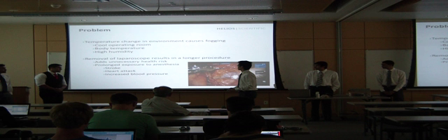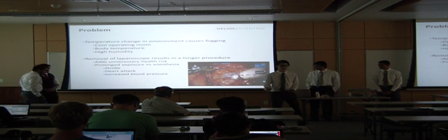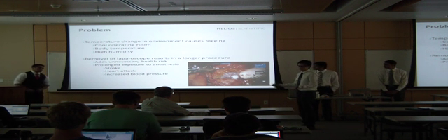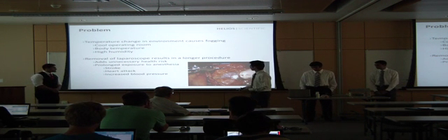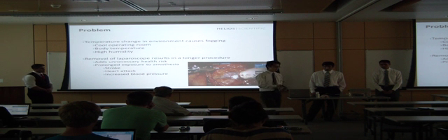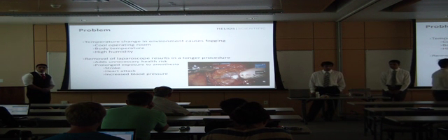The problem with using a laparoscope is that when it is entered into the human body, there's a quick temperature change from the operating room to the high 98 degrees Fahrenheit body temperature. This creates fog, so the surgeon cannot see out of the camera anymore. So the surgeon must remove the camera, clean it, and then carefully reinsert and reposition it. This may take up to 20 minutes and happens several times throughout a single surgery.